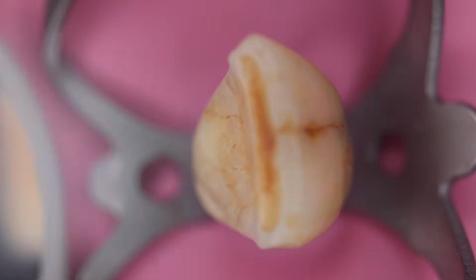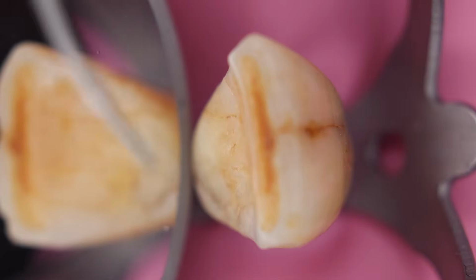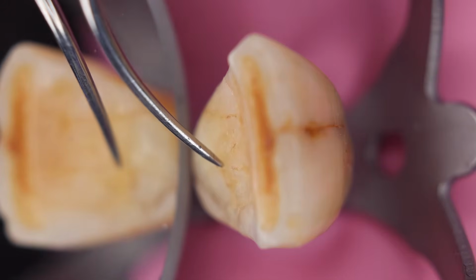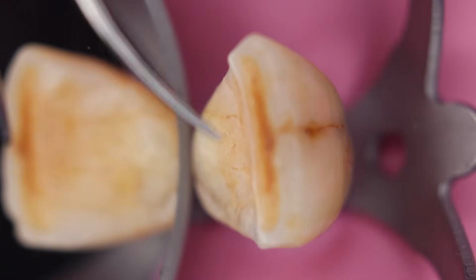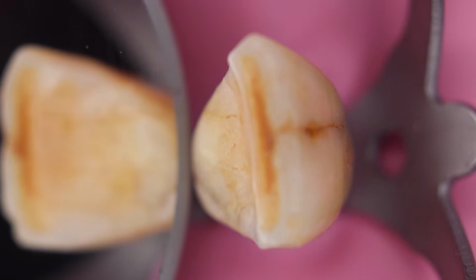Once you divide this tooth into three parts, the center point roughly comes over here. So this should be your approach, where you plan the access cavity preparation, when you imaginarily bisect this tooth in both the vertical and horizontal aspects.